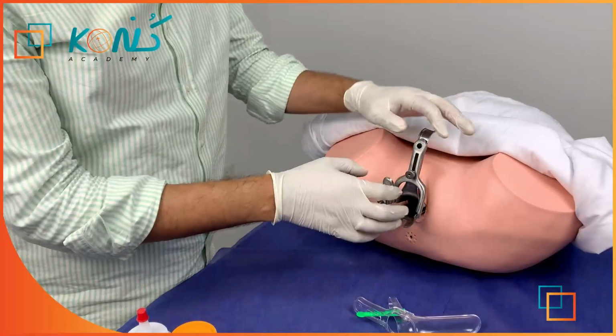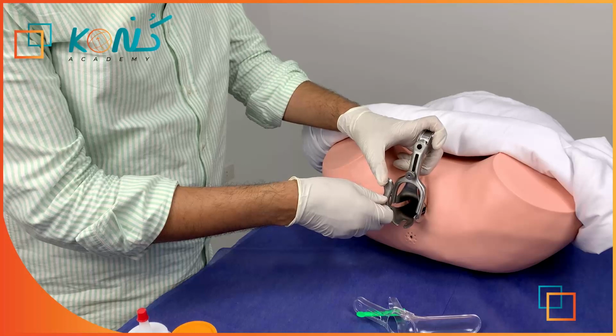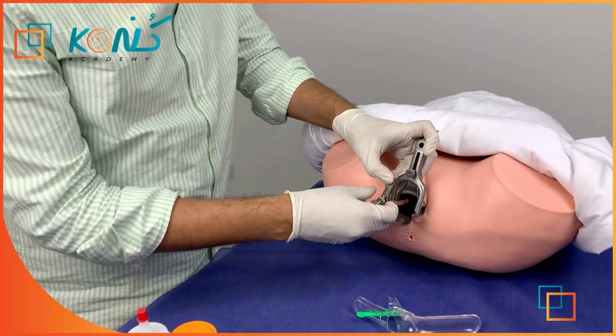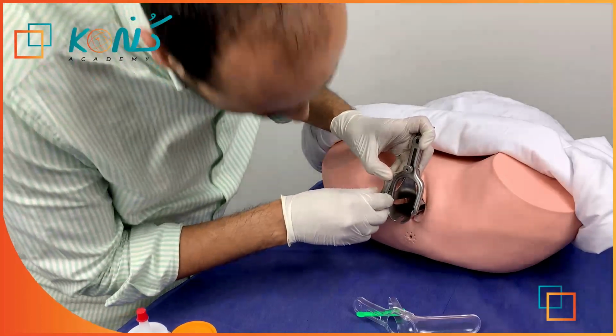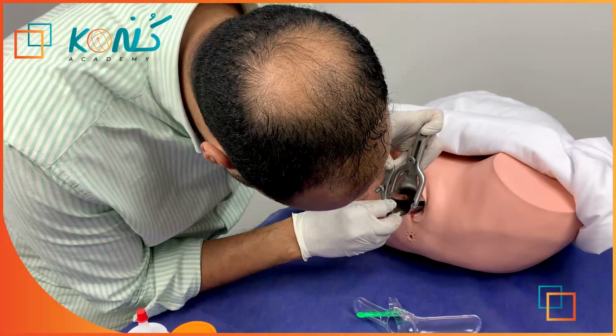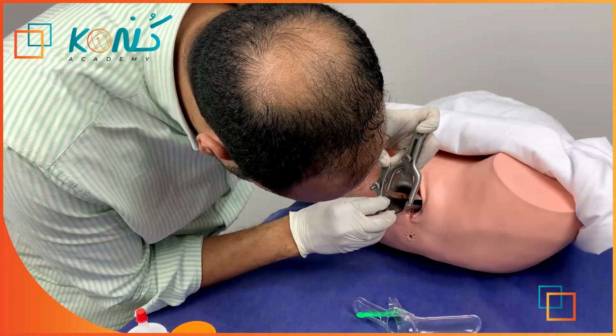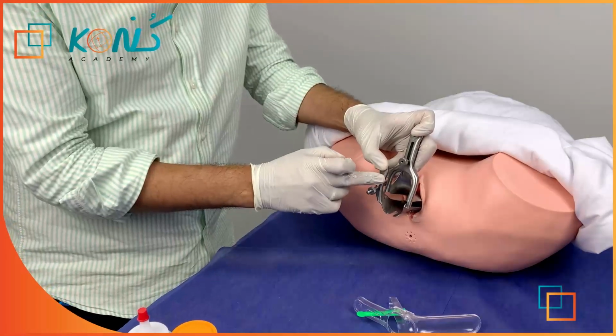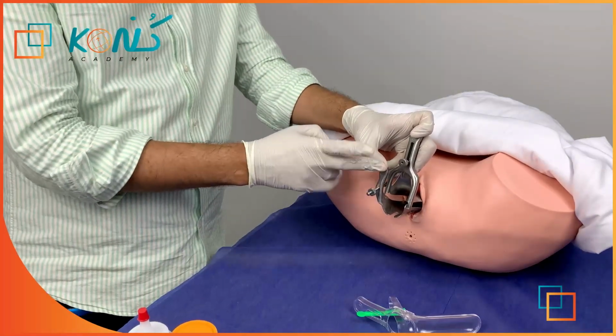Right now, the speculum is closed and we'd like to open it. We should loosen this screw. After loosening this screw, right now, we can open it. And you can right now see, by pressing over this blade, you are opening the speculum.